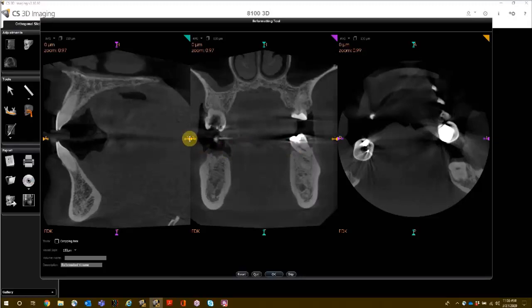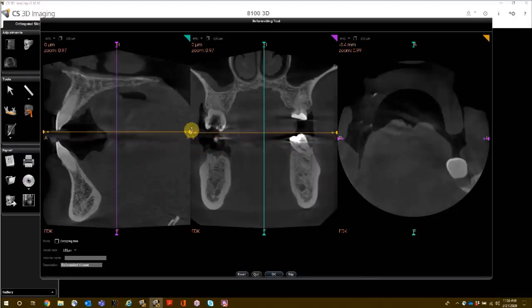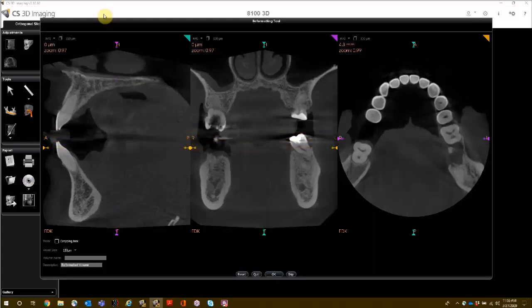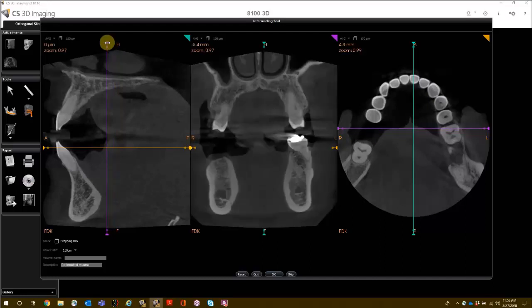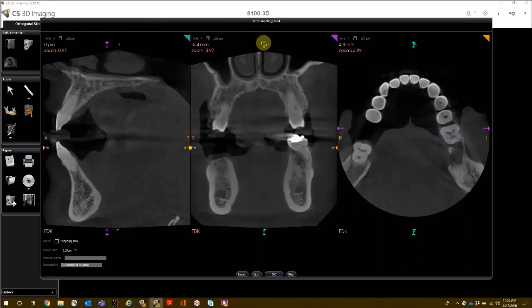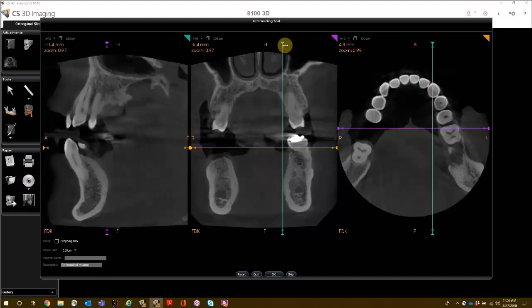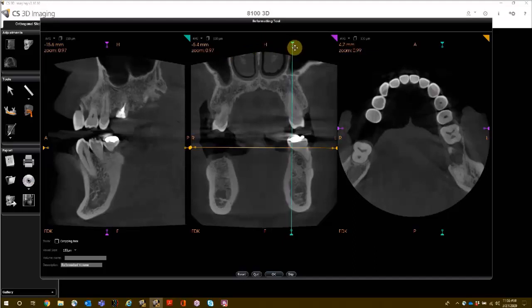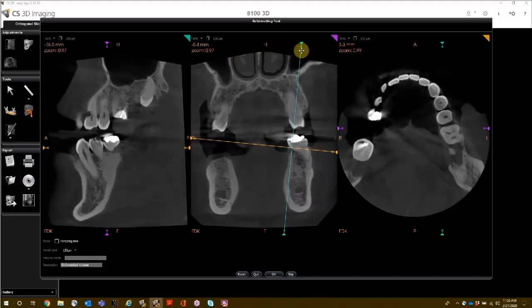The control points allow you to change the positions of the axial slice, the coronal slice, and the sagittal slice. The inner dots allow you to make angle adjustments.